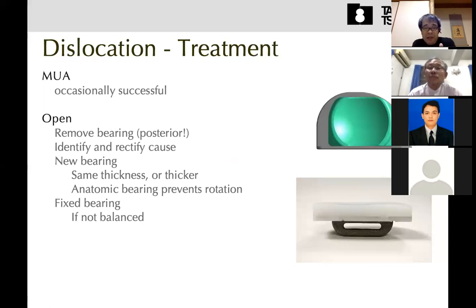So only flexion, and then extension. After that, surprisingly, sometimes this bearing is reduced. But in most cases, we need open reduction, so remove the bearing.